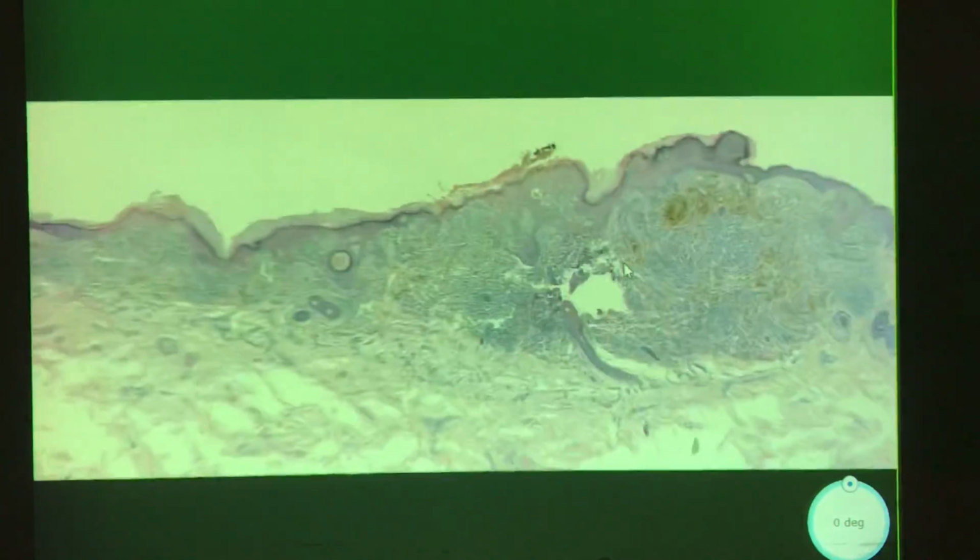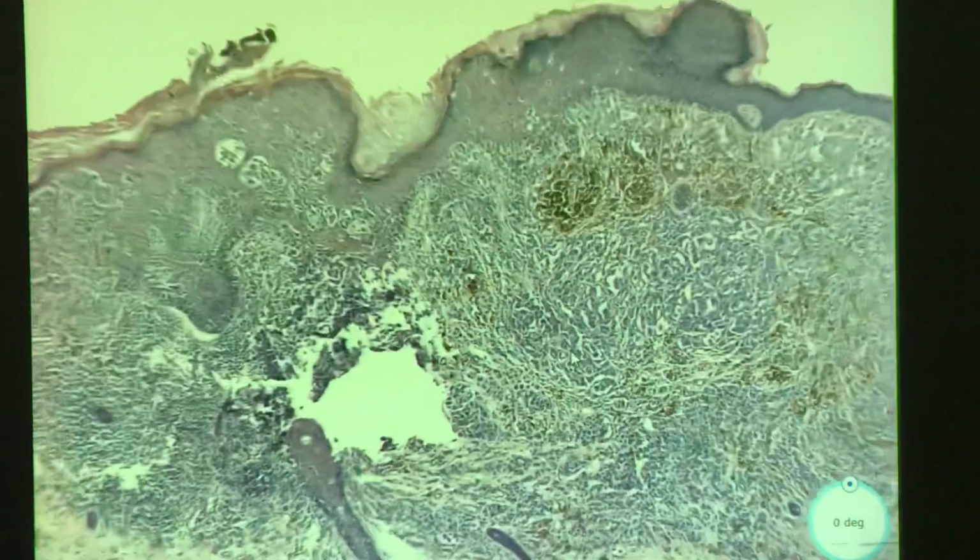This is case 13. This is our last case for the day. Right. The skin, I think the interesting part is here. Looks like, ooh, okay. Lots of, well, this is definitely melanoma. This is way too weird looking to be non.